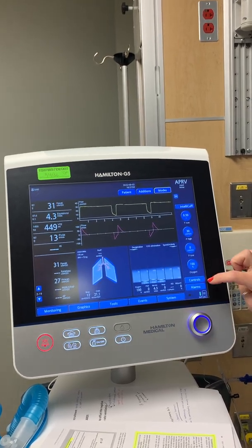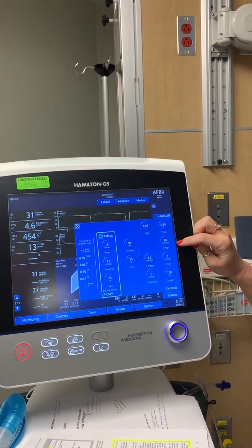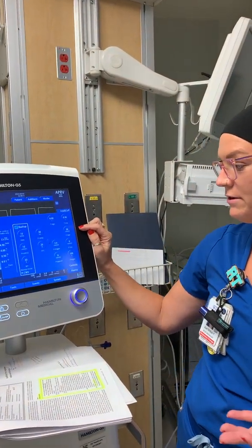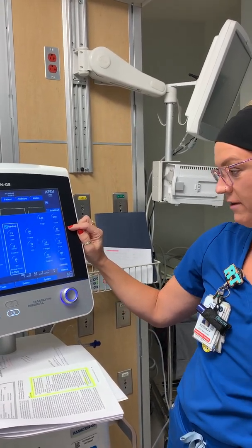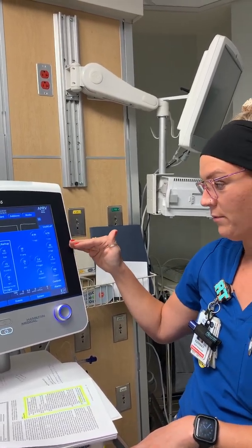There are four main settings. Your P high is essentially your plateau pressure — usually about 20 to 30 is where you're going to start. Try not to go above 35 for your initial P high; I know sometimes the plateau is higher than that, but 30 is about where you want to be.